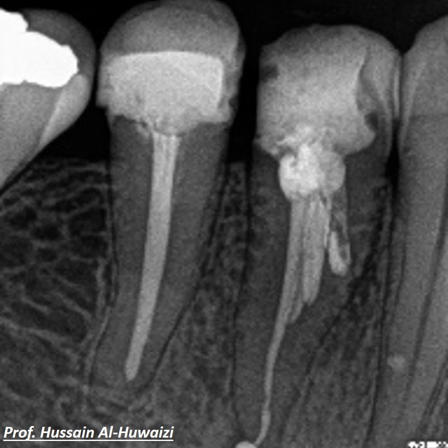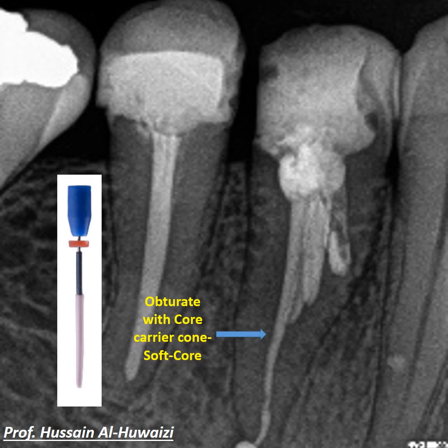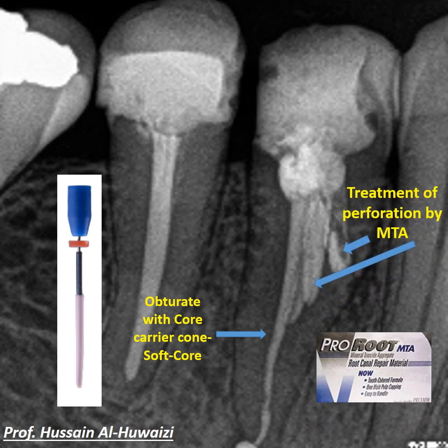The obturation phase was performed using the soft-core carrier cone obturation system from the CMS company in Denmark. Obturation of the perforated areas was done using MTA.